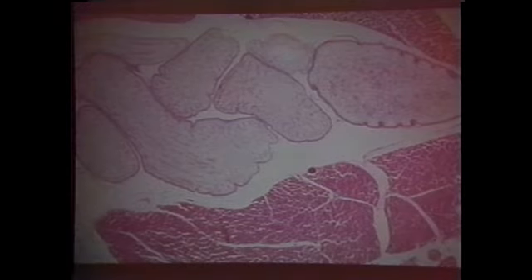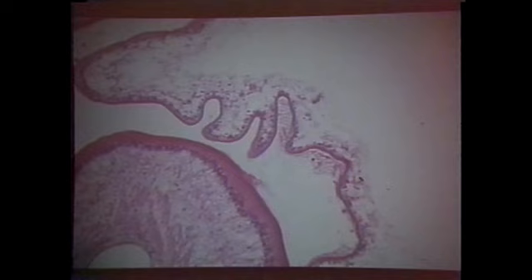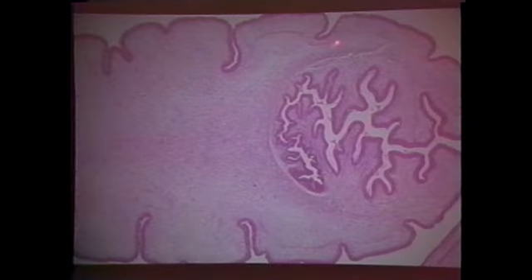Another form of larval tapeworm is a sparganum. Notice the sarcocystis. Anyway, here's a sparganum, and it's just solid. It does not have a scolex, and it's found in connective tissue and muscles of many types of animals. Here's a nice little mouse, and notice these little cystic things, and I tease them out. Here's a cyst, and here's one out. And we find that it has a bladder and a scolex, and the scolex has a rostellum and suckers, and that's a Strobilocercus.